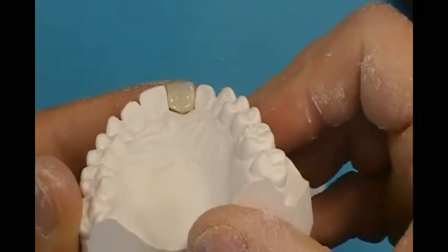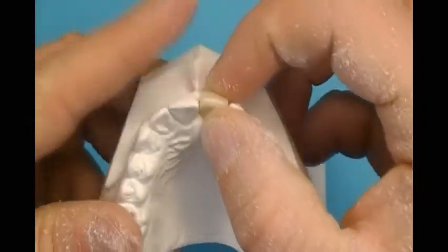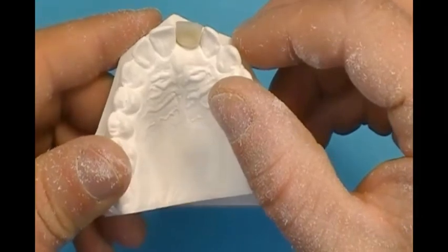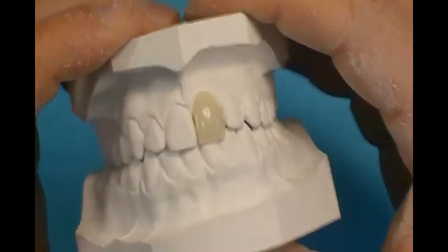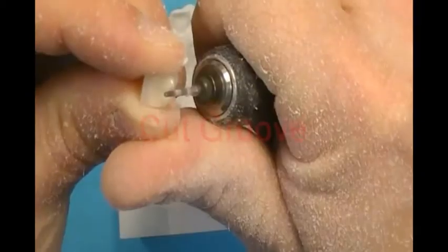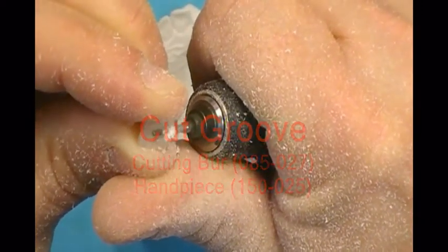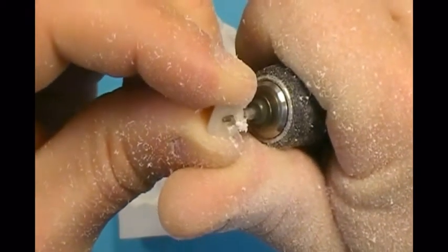Check the size of the trimmed pontic to the edentulous space. Also check alignment to the arch and opposing model. Cut a groove into the lingual area of the plastic tooth with a carbide cutting bur and lab handpiece. This will increase tooth-to-retainer acrylic adherence.